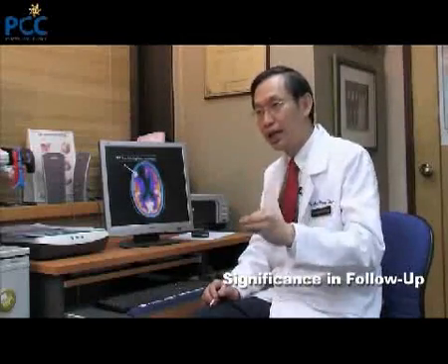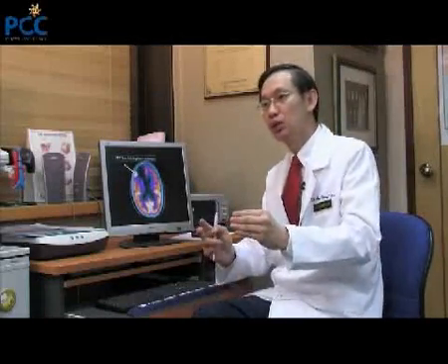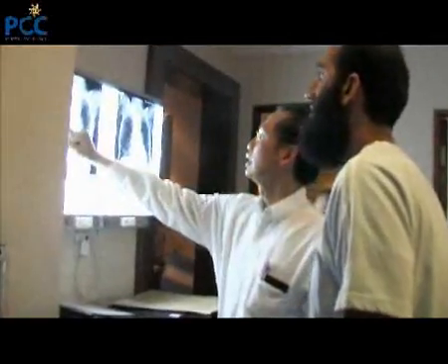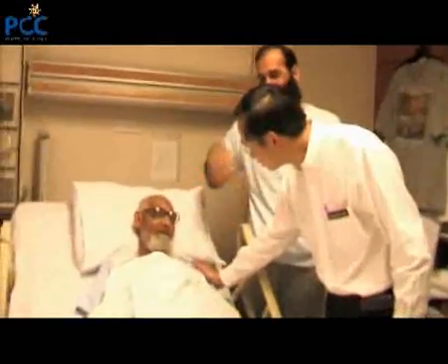Besides helping us in staging the cancer — meaning what stage it is, whether it has metastasized or not — and in helping us determine whether the tumour is responding to treatment with before and after pictures, the PET scan is also useful in helping us follow up a patient to determine whether a patient has or does not have a cancer recurrence.